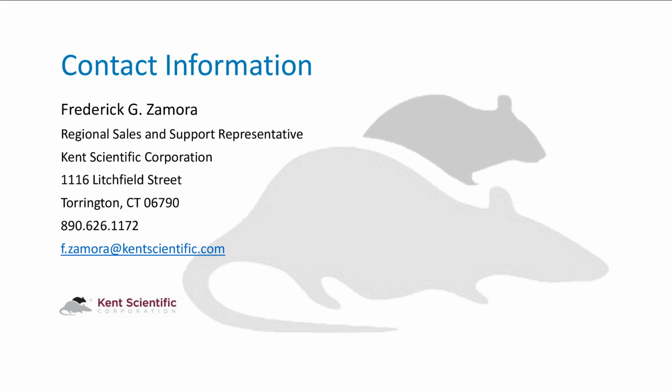If one is set as low flow to be more of a maintenance, and one is set for high flow, perfect. So in this case, let's say you are using 3 animals. You can use the high flow for inducing your animals all at once. And then once you transfer them to your face mask, you can set it to the low flow to maintain the flow rate, or for maintenance of the anesthetic plane. Again, you can adjust it as necessary depending on how your animals are reacting at that particular time. So hopefully that answered it.